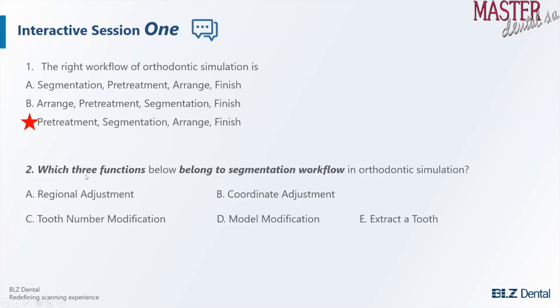Question 2, which 3 functions below belong to segmentation workflow in orthodontic simulation? Maybe this question is too early for us because we haven't made the presentation of this workflow for you, but we can just regard this as a guess. A, C, E belong to segmentation workflow, okay?